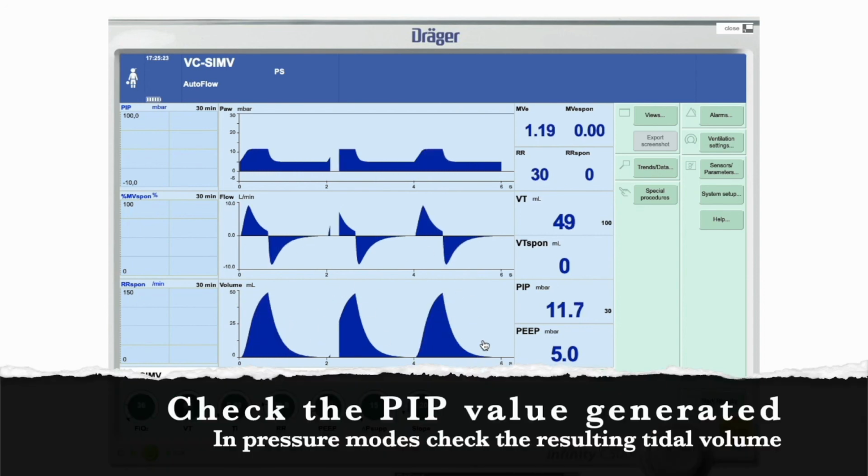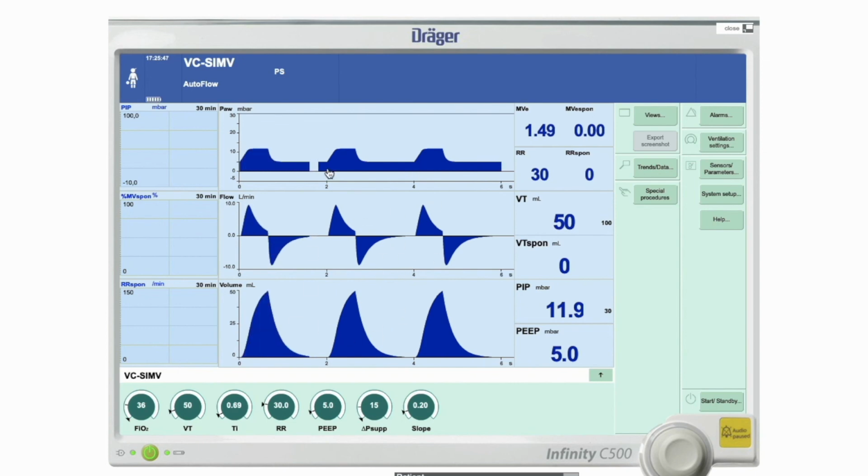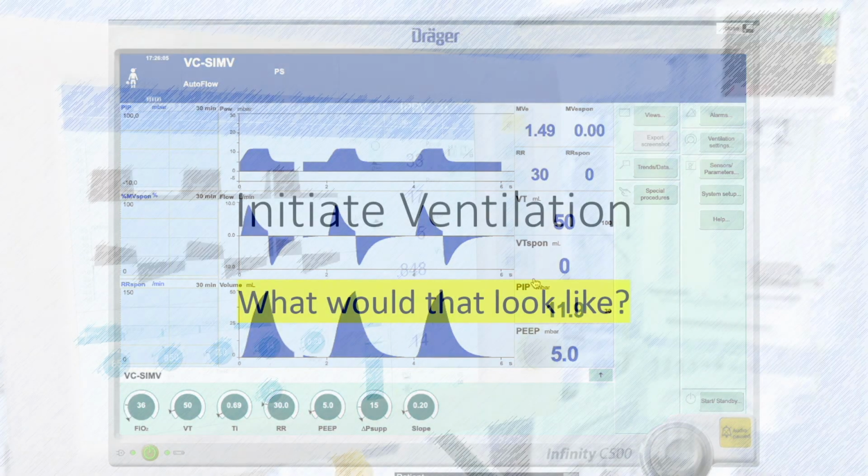So once we've started that, we now go and look at the patient. We make sure that he looks comfortable. We make sure that he's got decent chest rise. We then notice whether or not he's got a leak or not, that the tube's in the right kind of position. Then after that, we look at the monitor and we see what sats have we got, what the end tidal CO2 is doing, and then within 20 minutes we'll get a gas. We'd also need to get a chest x-ray just to see where the tube is, and obviously we would need routine bloods as well. So that's kind of like a rapid run through of what we would do when we were setting up a child on the ventilator as he comes into the unit.